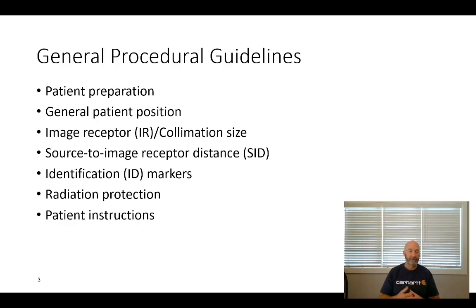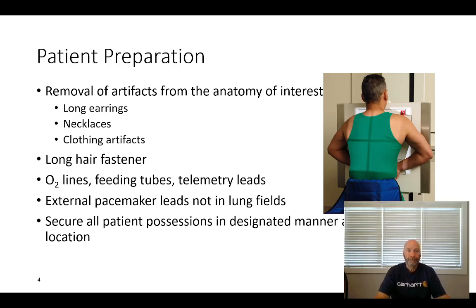Your patient instructions are very important. Tell your patient what you're going to do, what you need them to do, and if there's breathing instructions, include those as well. We'll talk about those in a bit.